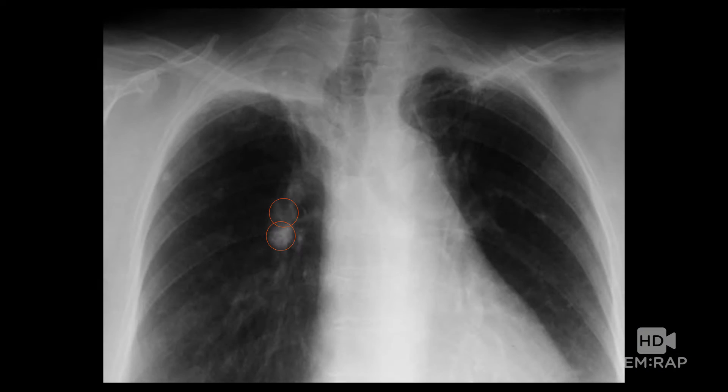Is this next one part of the calcification thing you were talking about? Yes — the bugs come in, you get a little calcified. This is the kind of thing you might see. This could be consistent with prior exposure to tuberculosis.